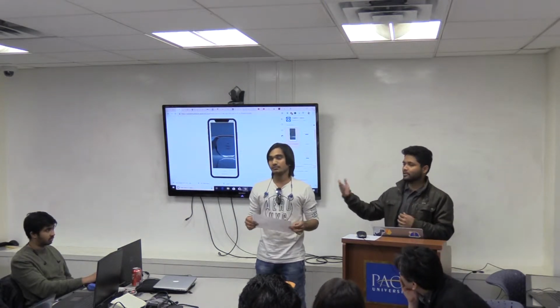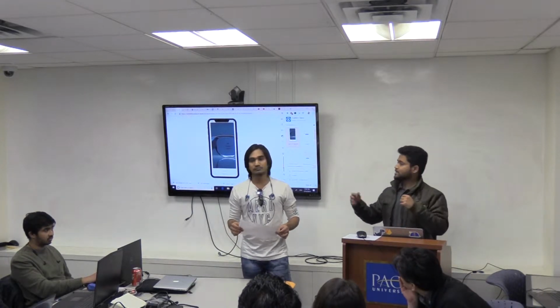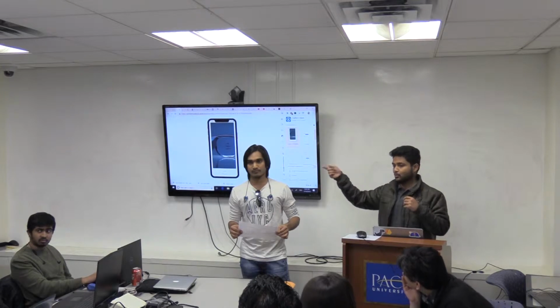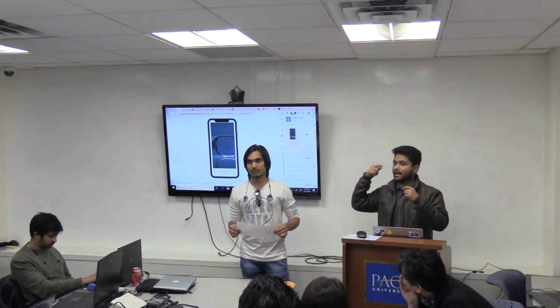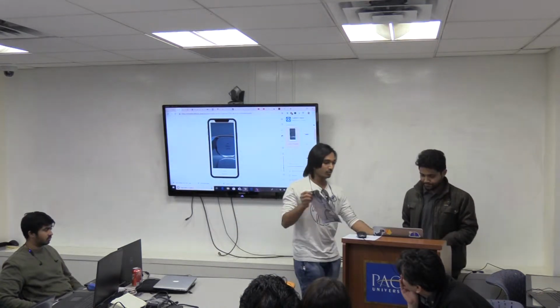Suppose I am having a conversation with him and I am deaf here. What my glass will do is, he'll speak something and my glass will have an API that will convert that voice into text, and I can see it on my glass. So that's what he was explaining. Yeah, and the workflow goes like this.